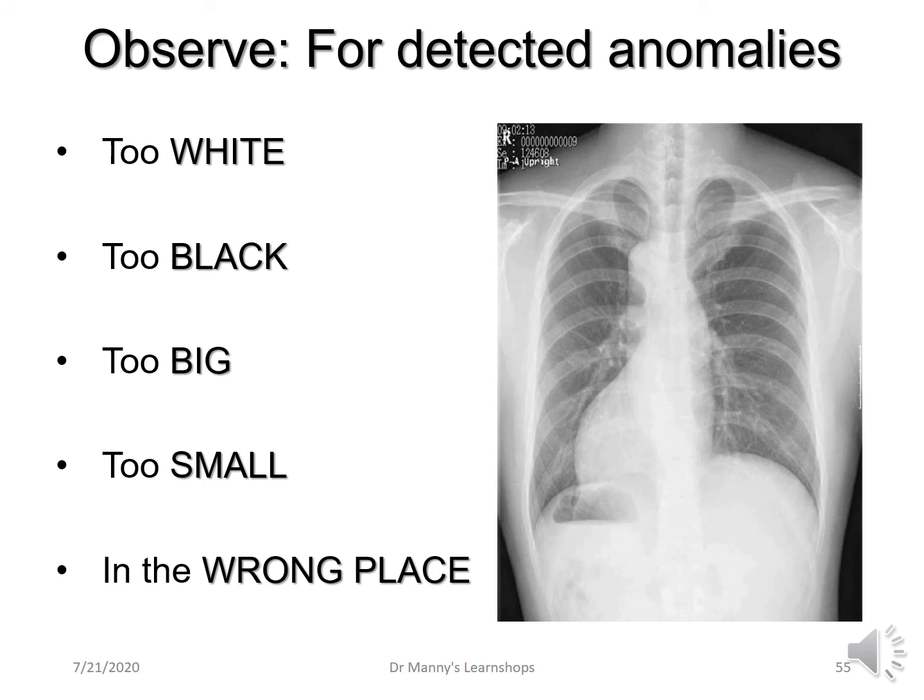We can all look at the chest x-ray basically to identify certain situations, conditions, which is why the x-ray may have been taken, but really the radiologist will be the one that makes the interpretation and will document as such to give us information.